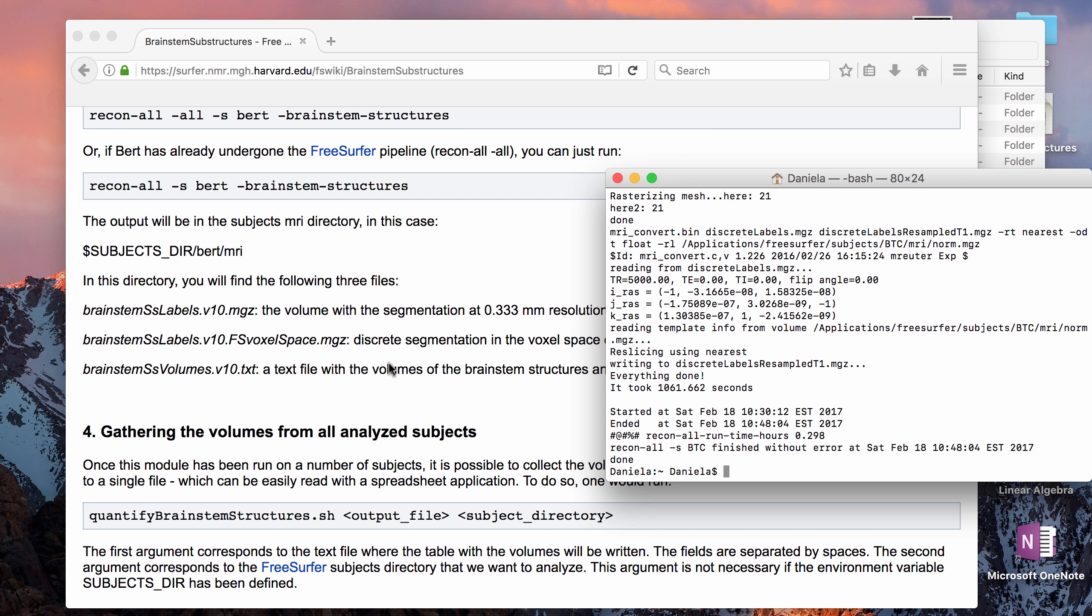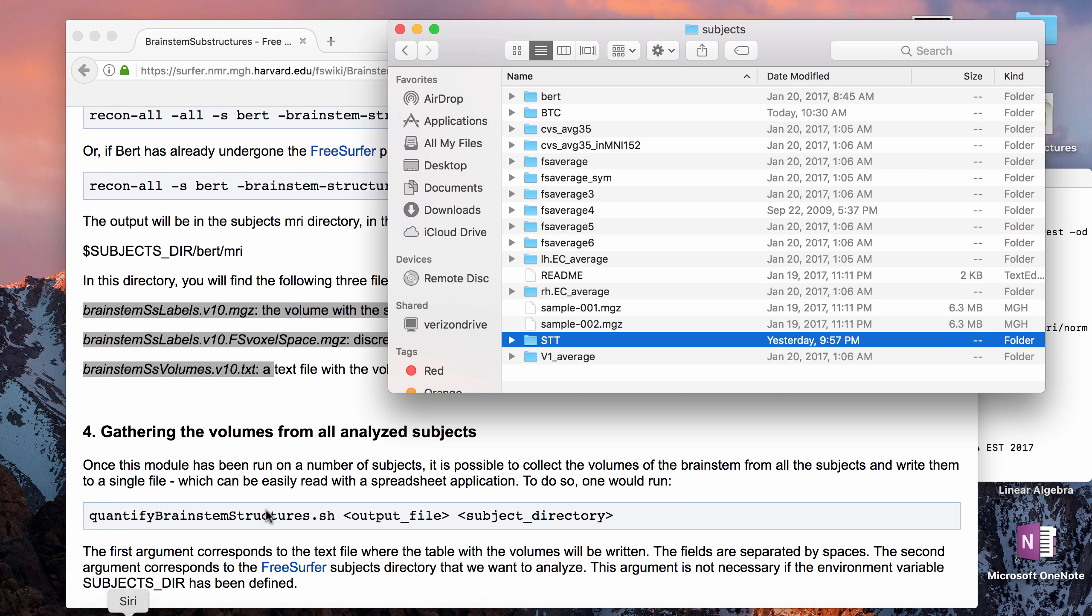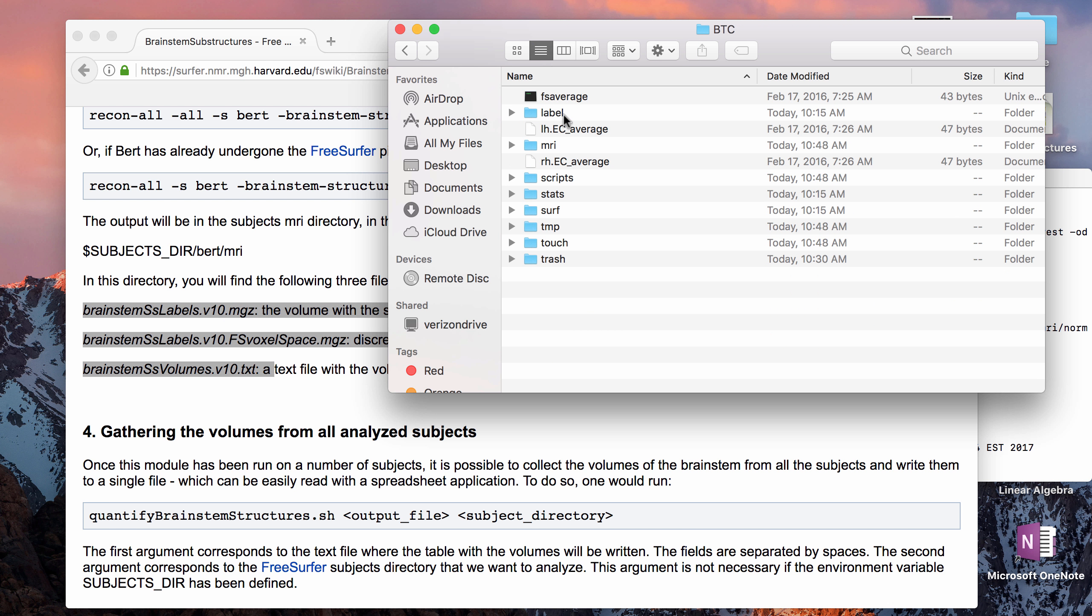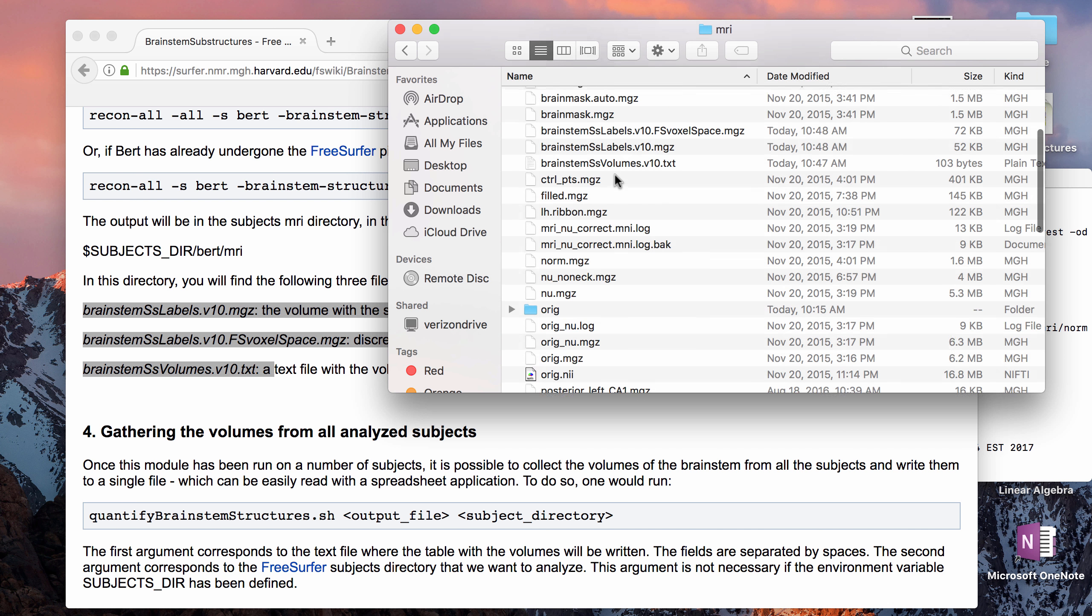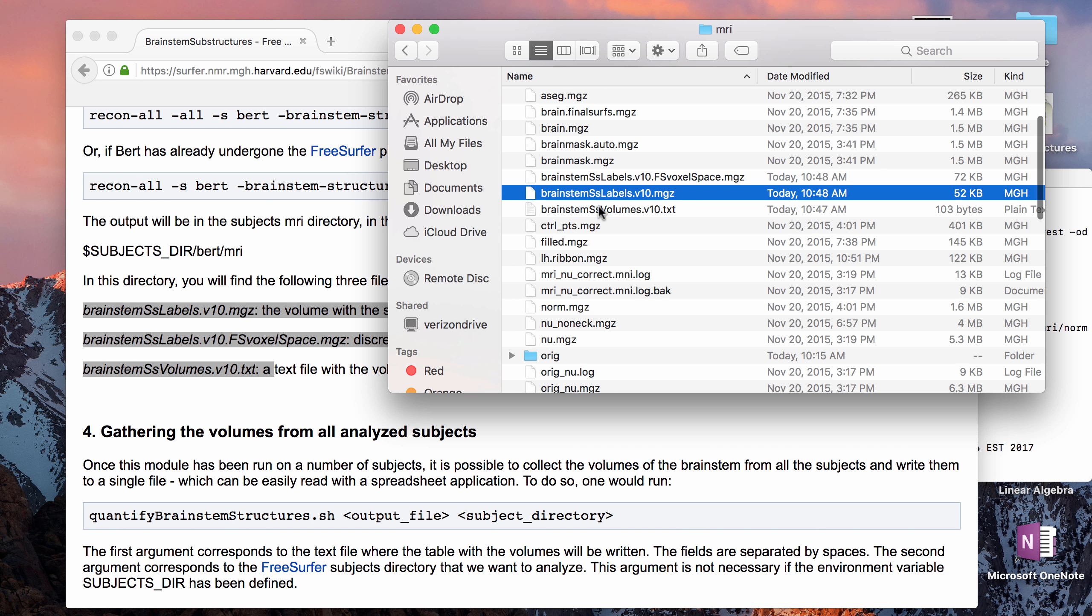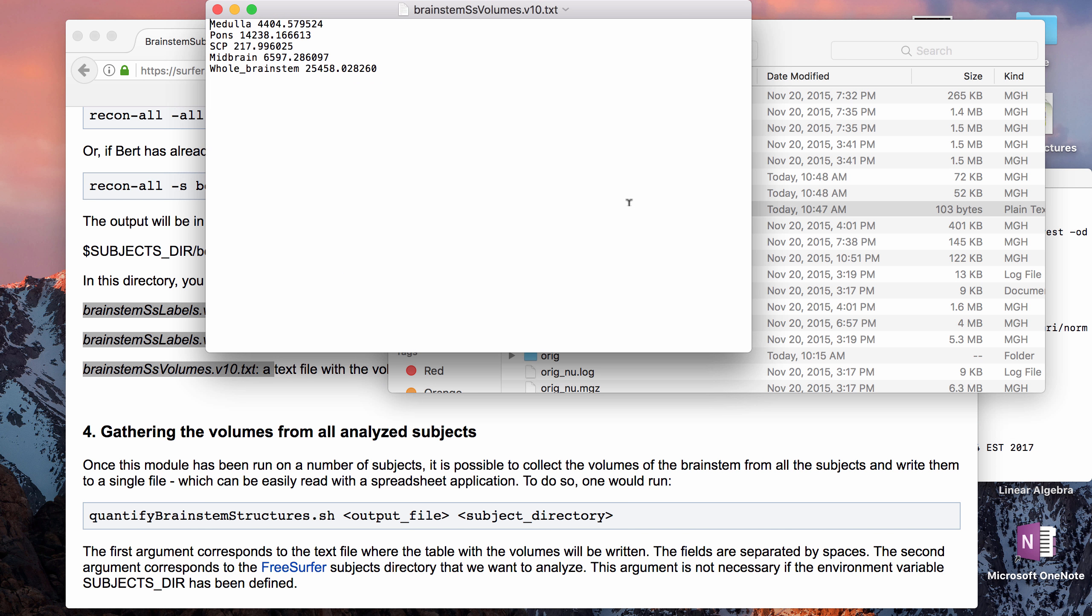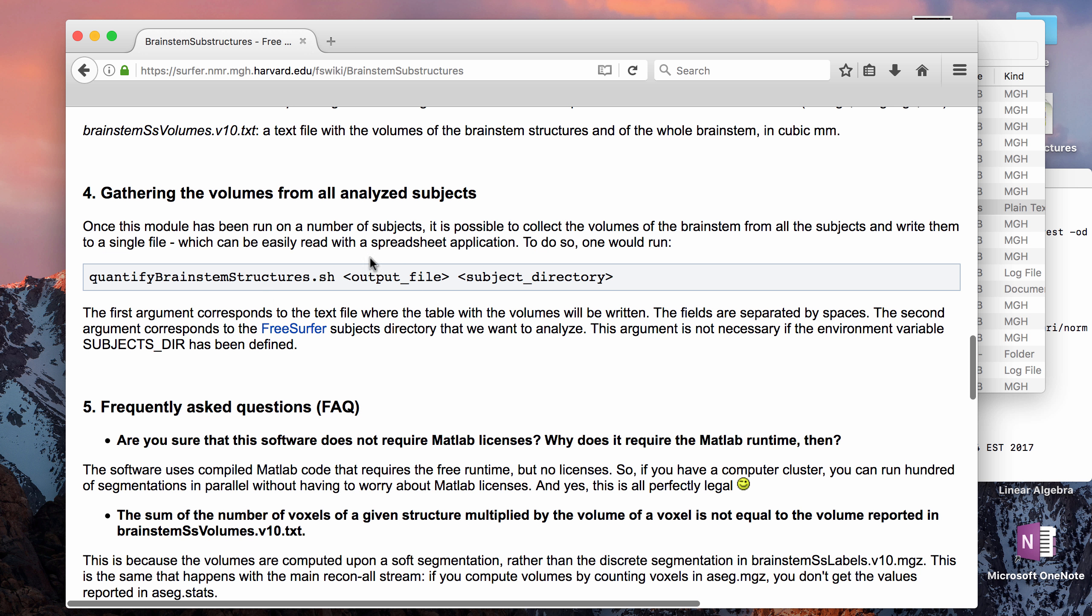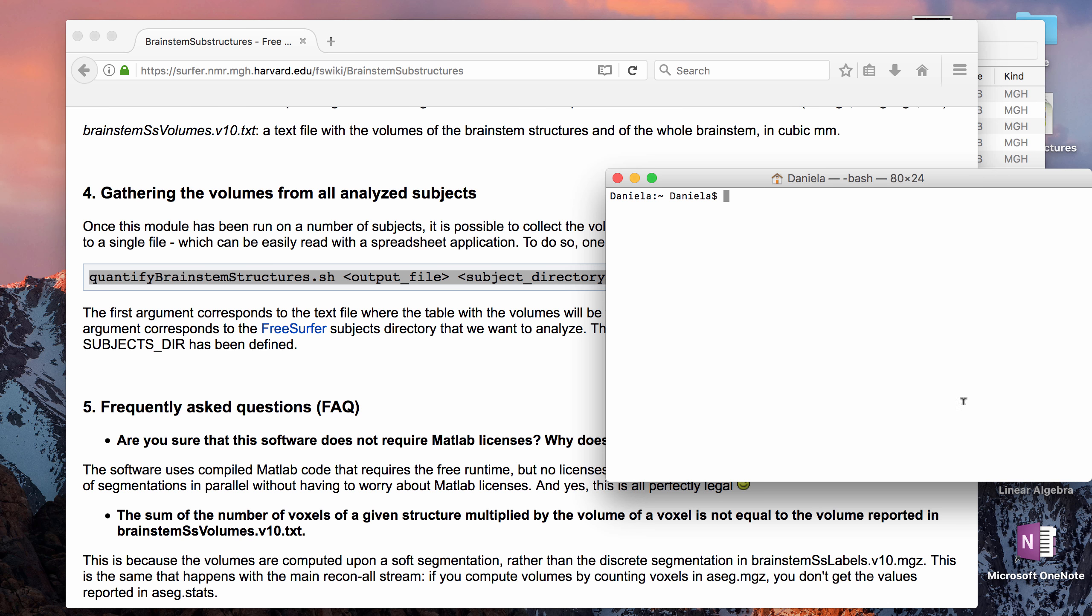This tag will produce three extra files in your MRI folder, so you can check the files once they're done. If you go into the MRI folder, you should see three brainstem files and they are there. The two files are two label files and one volume file, so you can get morphometry data from the brainstem. It also has a bash or shell script that you can do if you have multiple subjects. I'm going to test that out because I have two subjects now that have brainstem data.